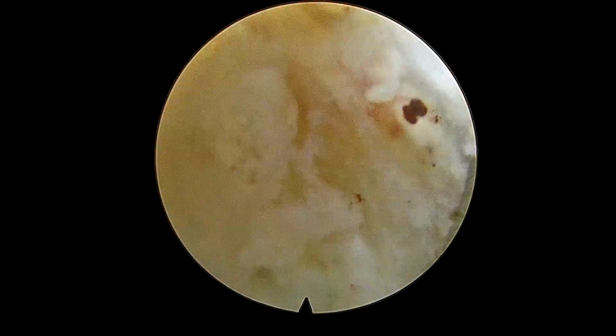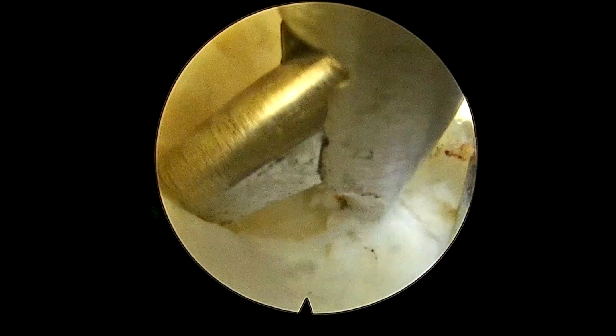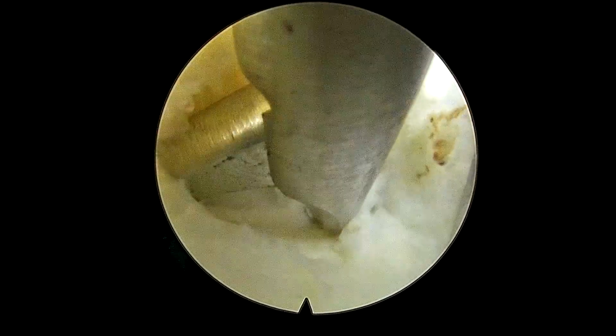I'm trying to cut the ligamentum flavum layer by layer from superficial to the deeper layer. The important part is that the tip of the annular cutter, which is one of the sharpest instruments, should always be under vision. So rotate your camera as per your need, but all the time the tip of the annular cutter should be in the vision. You can see here we are gradually going towards the deeper layer.